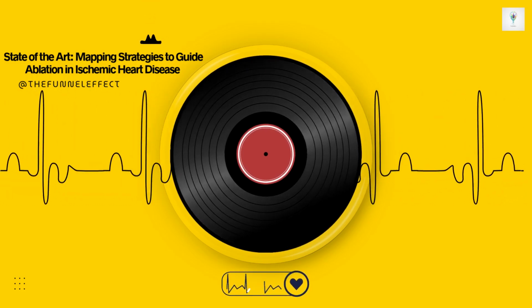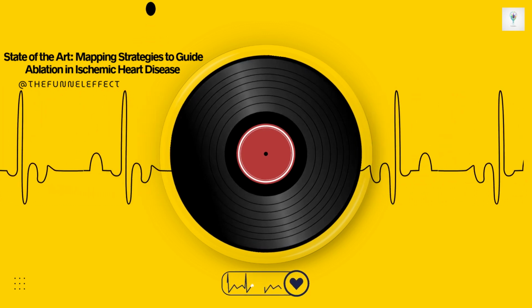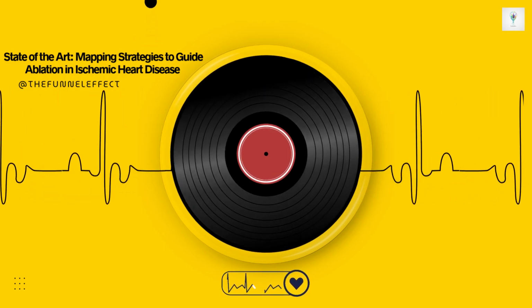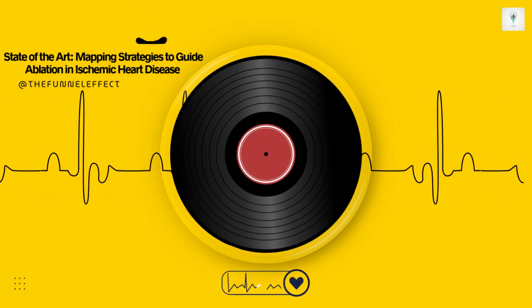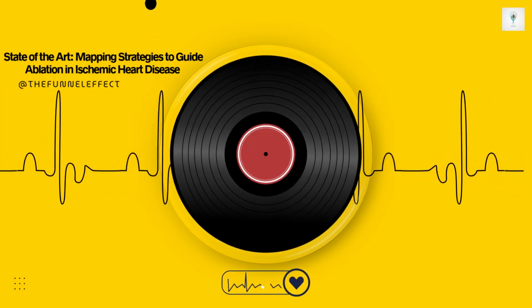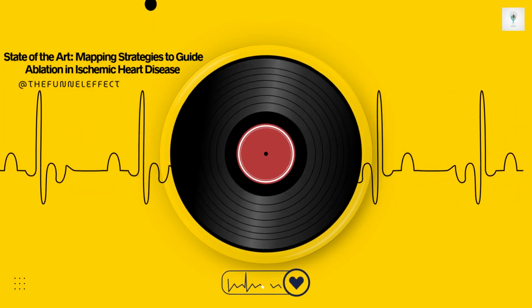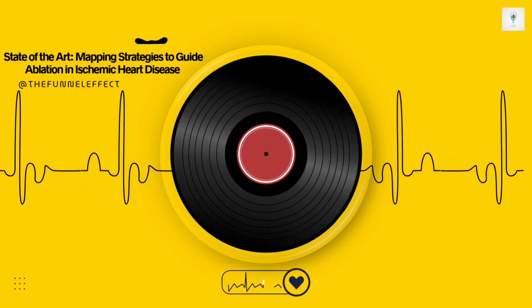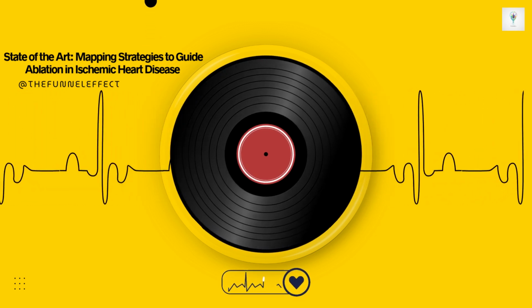Okay, let's shift gears to strategy B, mapping during the actual ventricular tachycardia. The high-risk, high-reward approach. It sounds intense. When does the team decide, okay, we need to map this live? Yeah, the decision to map during VT isn't taken lightly. It's usually driven by necessity, often when substrate mapping hasn't been enough. The review points to three main scenarios. First, if the VT is incessant, meaning it just keeps starting up again, or it's running continuously during the procedure, making stable mapping impossible. Second, if the patient has already had a prior substrate ablation attempt that failed. The VT came back, suggesting the first approach missed something critical, and now you need the precision of live mapping.